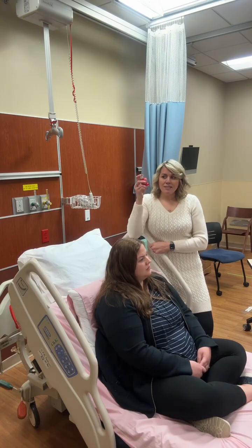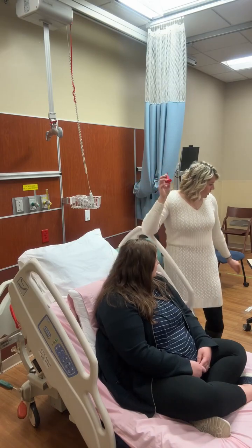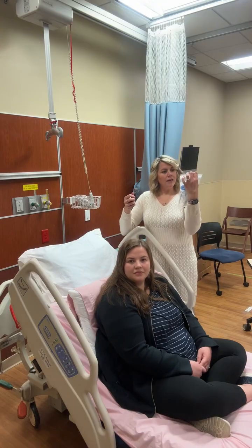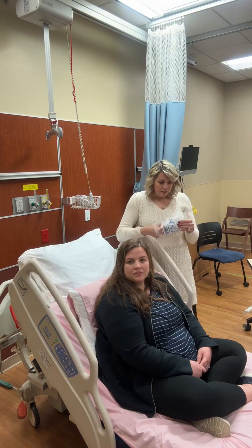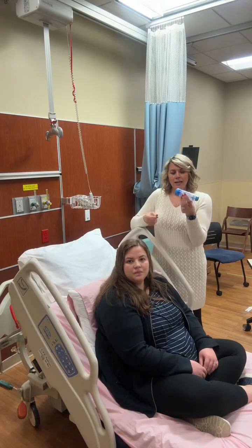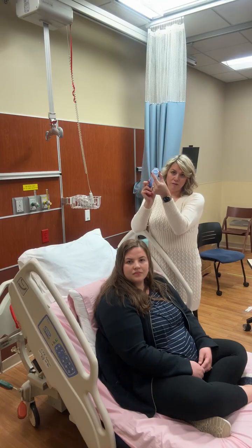Now, let's say the patient just cannot maneuver that coordinated breath hold. So we have what is called a spacer. That's the generic name, but there are aerochambers with all different names. But typically, it is this fancy tube here, and it has a one-way valve in it. So when I take the cap off, right here is a one-way valve.